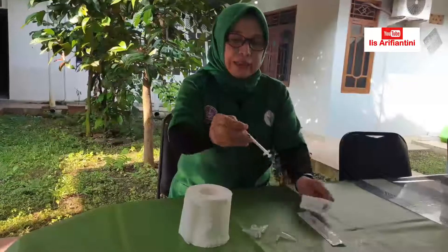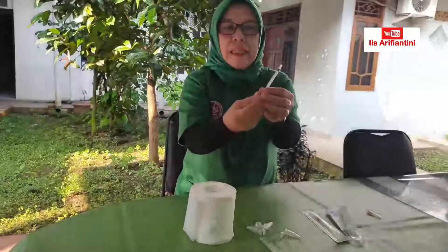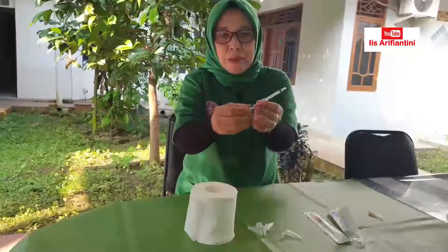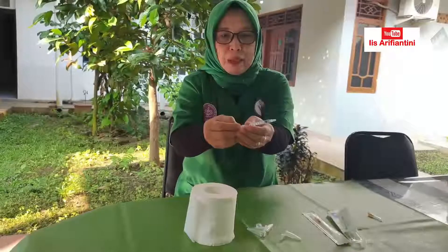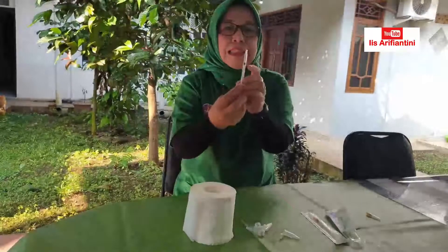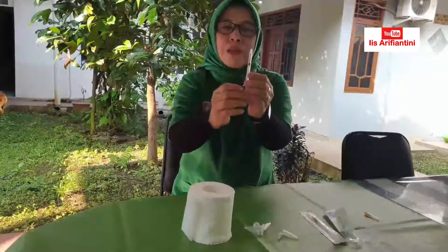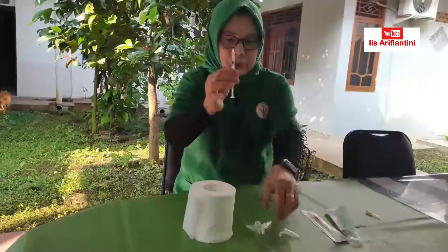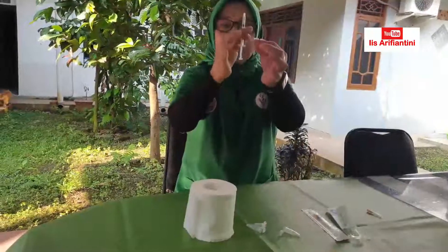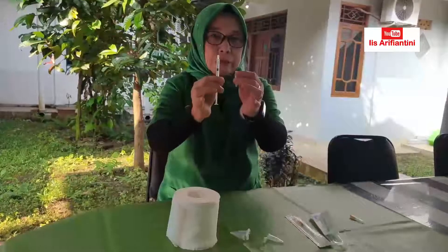Atau yang mudah menggunakan alat suntik — kita angkat jarumnya. Ini bisa langsung digunakan pada saat massage: satu orang mengambil semennya menggunakan alat ini. Kalau menggunakan alat ini, yang menguntungkan adalah sudah ada tanda skalanya sehingga kita mudah mengetahui berapa volume semennya. Kalau menggunakan tabung biasa, kita harus menghisap kembali dan mengukur, dan kadang-kadang tidak terhabis semua karena semen ayam lengket — dia tidak ada plasma semennya, jadi lebih banyak disebut dengan semen kental.